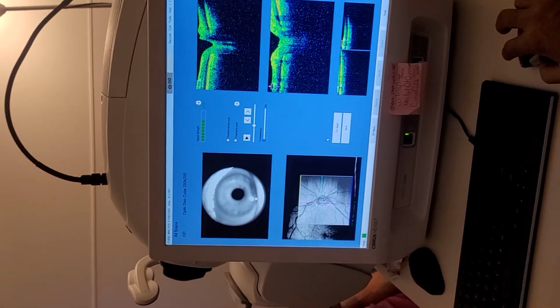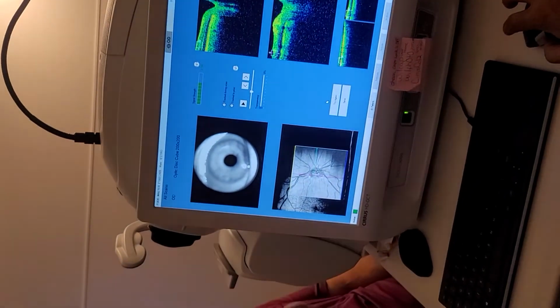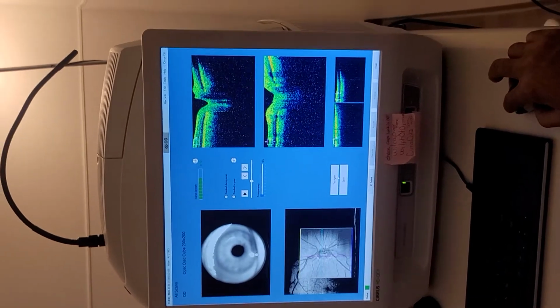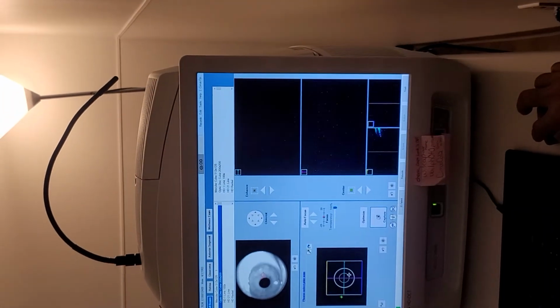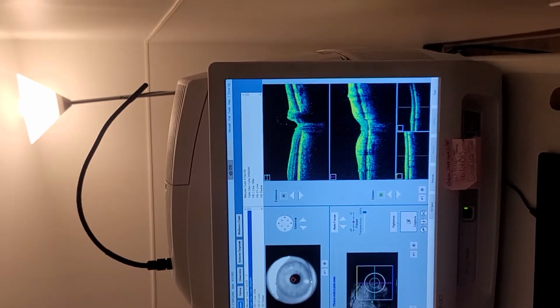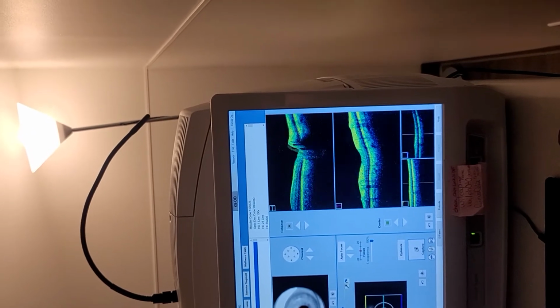But if that's the best photo that you have, it will be good. But you can retake it on him. Let's retake it and don't save that one. Or if you don't think you're gonna get a better image, then you say, okay, that's good, and just move this to make sure that's in the center.